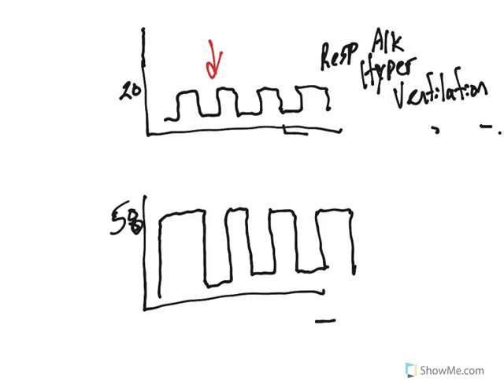Geez, that's a terrible 8. 58 is the number here. And so this patient is actually acidotic, but you note that there's not a lot of space between each of these. I think 2 of those arrows are okay. But you can see your patient is, in fact, hyperventilating, but look at their number. Their number is at 58. So this tells me that my patient has some acidosis, some buildup of acid, and they're blowing that off, okay? And this will tell me that this patient is compensating.